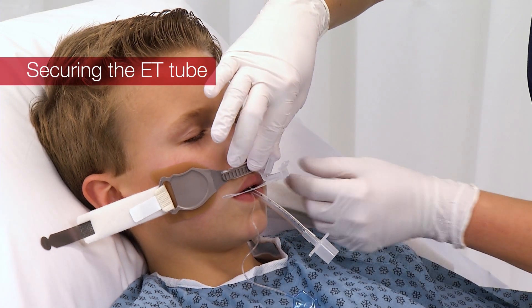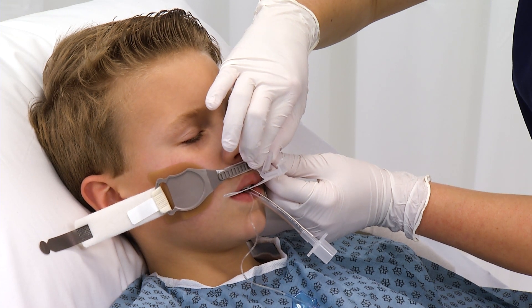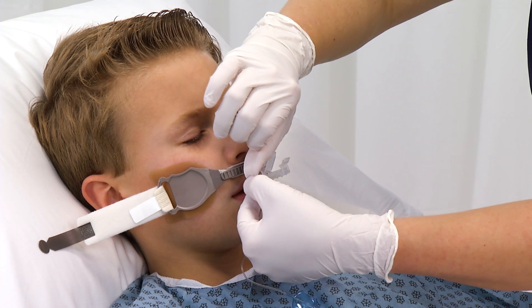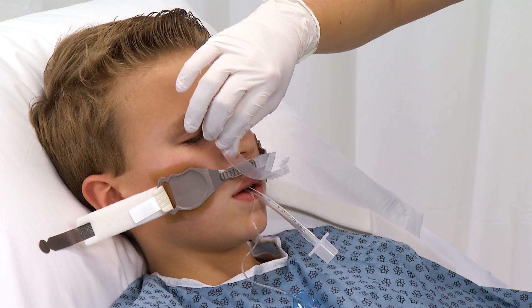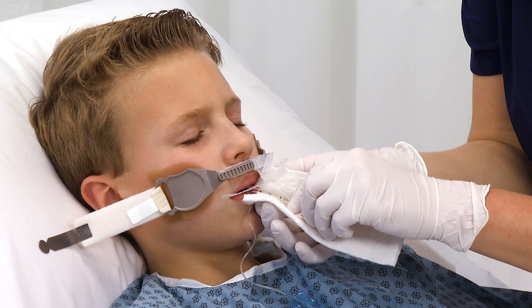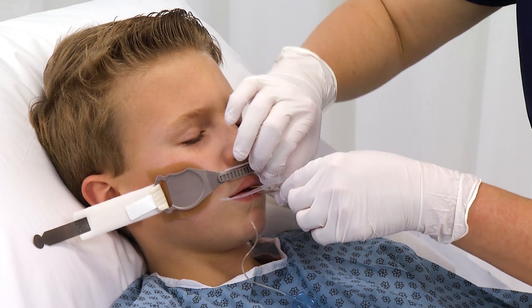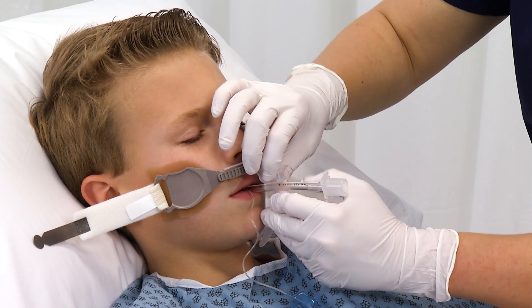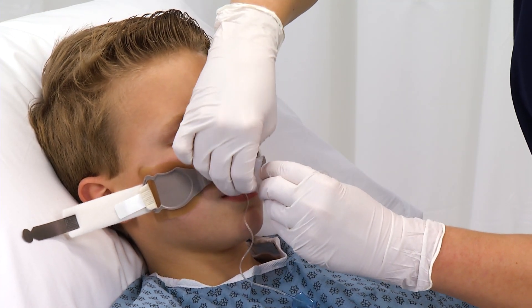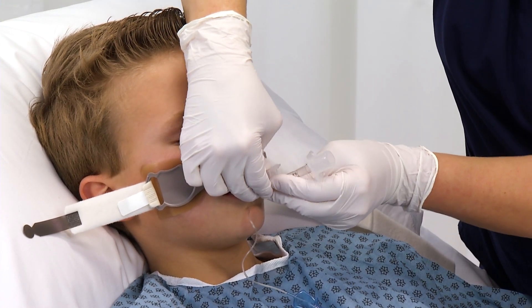Squeeze the tabs on the sides of the gliding tube shuttle and move the clamp along the track to a location adjacent to the ET tube. Remove the release liner from the ET tube wrap, exposing the adhesive. Before applying the wrap to the ET tube, make sure the ET tube is dry and free of any residue. Position the ET tube under the non-slip grippers. Loop the wrap tightly around the ET tube. Avoid including any other tubes within the wrap. Pull the remaining portion of the wrap through the security clamp. Secure the wrap by snapping shut the one-click security clamp. An audible click will be heard.